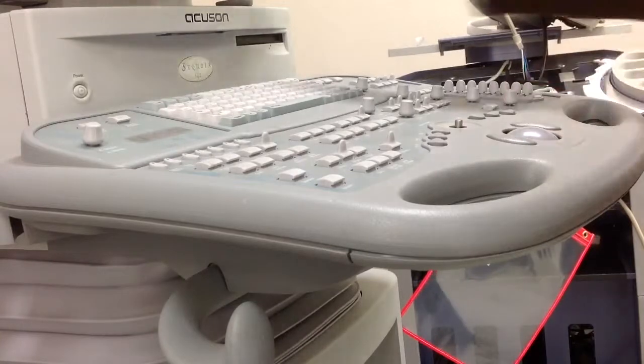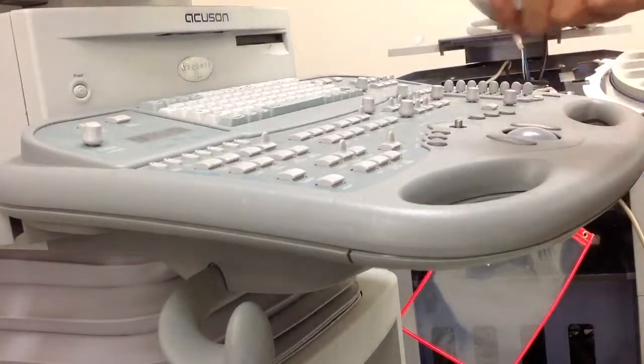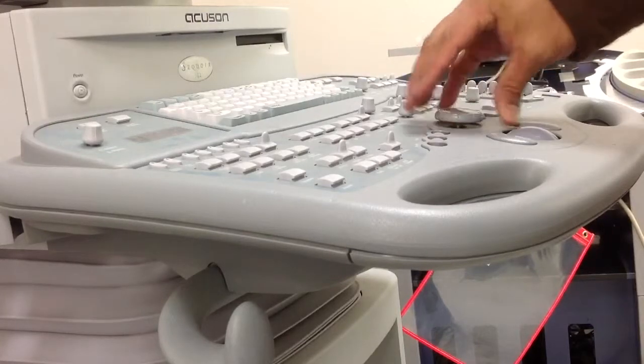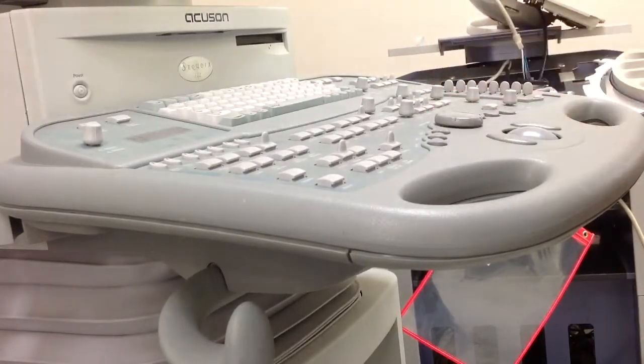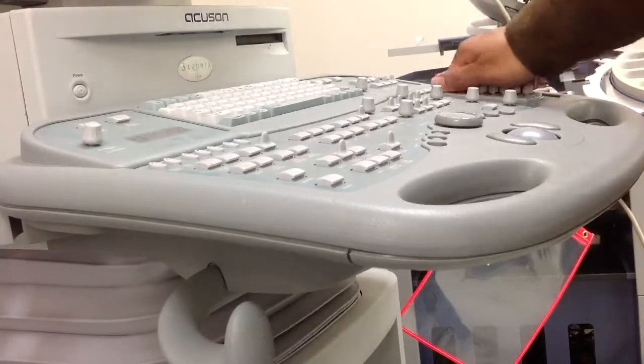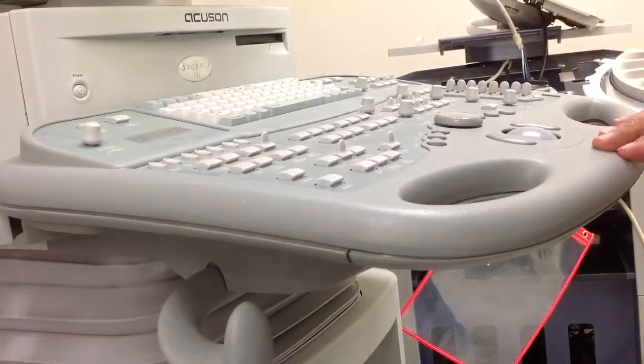And once you put back all the screws, you can put back the freeze knob, and then you power on the system and test the functionality.